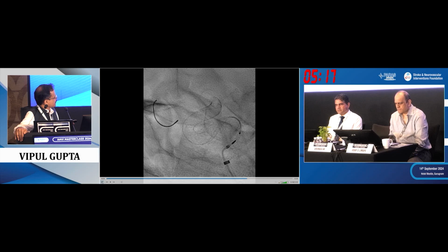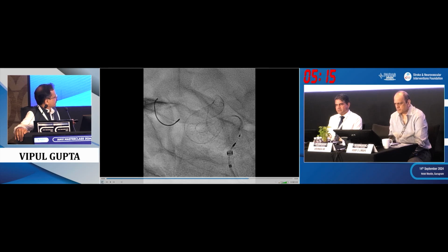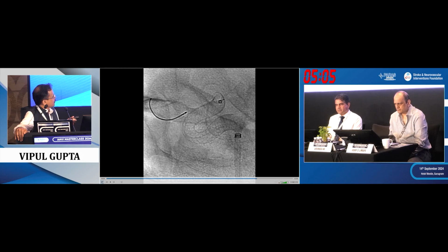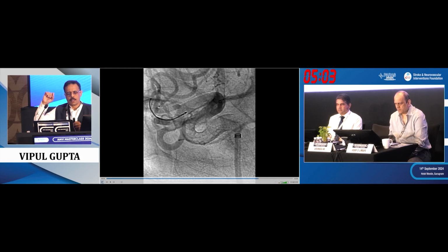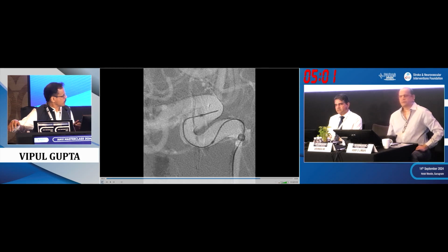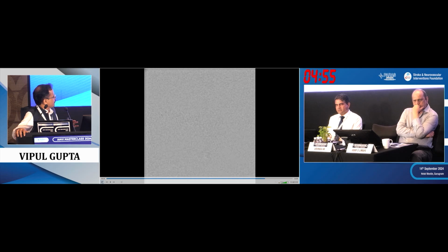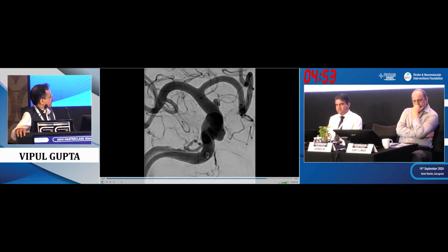You can see it's not well open here. It's not a major issue. We always withdraw the micro and the wire, and you can see it snapped open there. And then you use a microcatheter massage, and you can see we sort of shorten the flow diverter here so as to bump the microcatheter against the wall of the flow diverter. But I wasn't happy about this area. So yes, once you are not happy, it's acute. We did angioplasty as well.